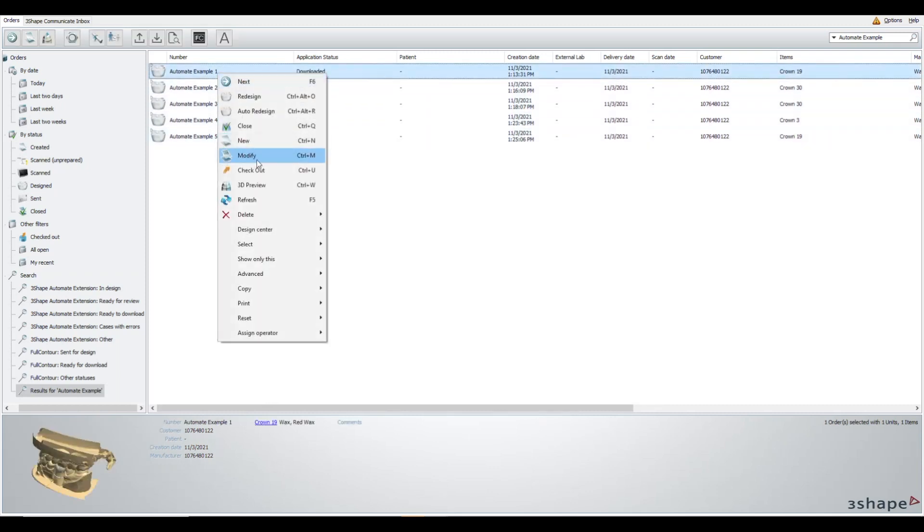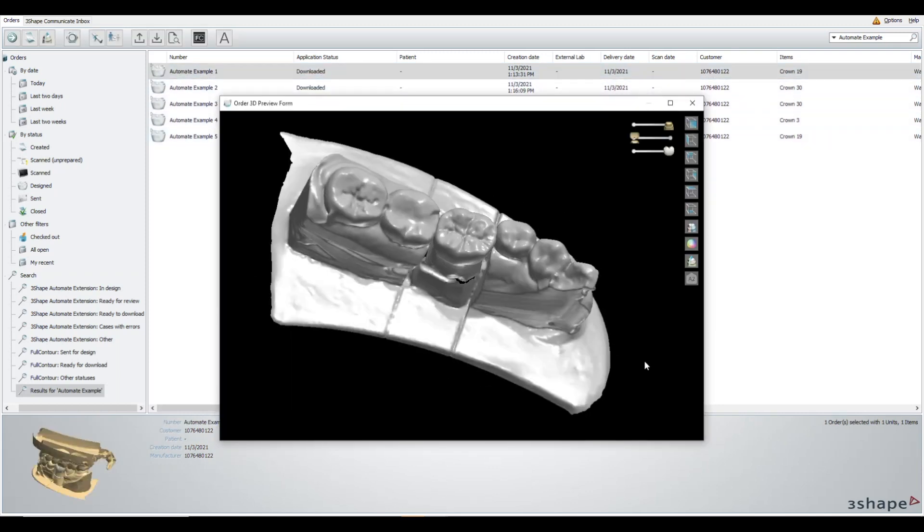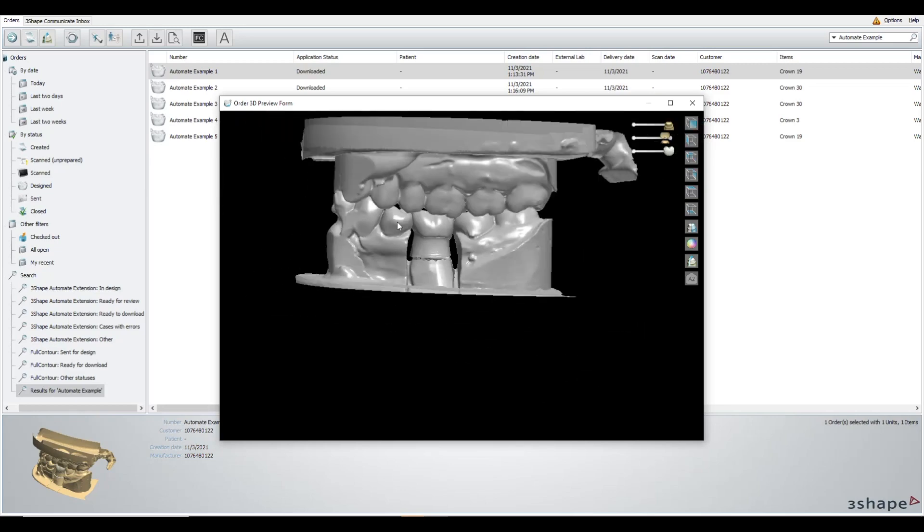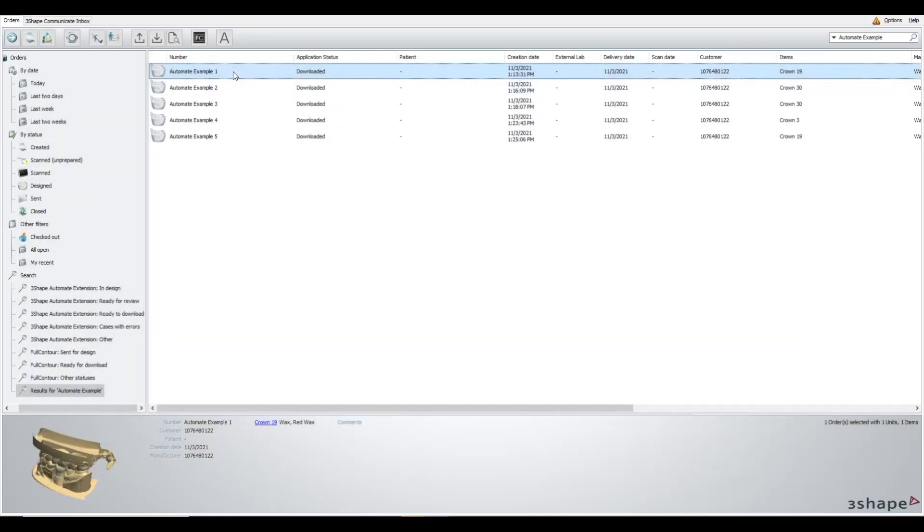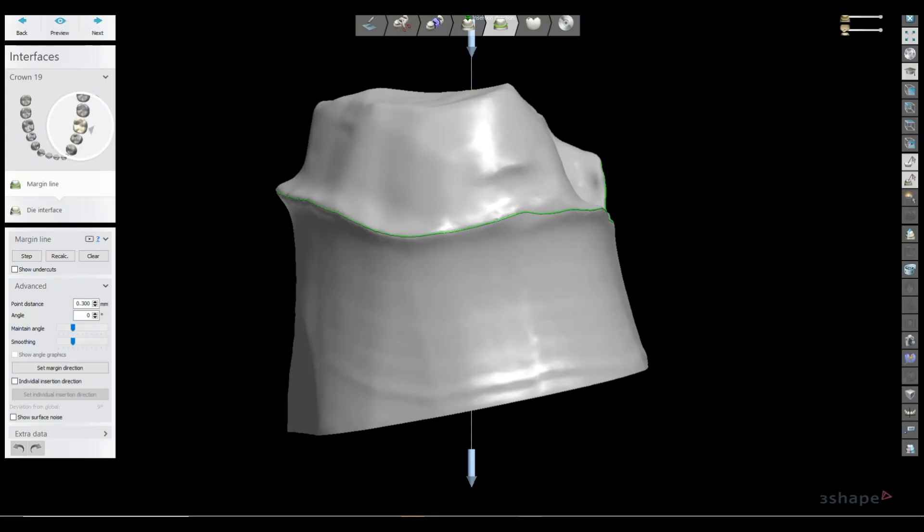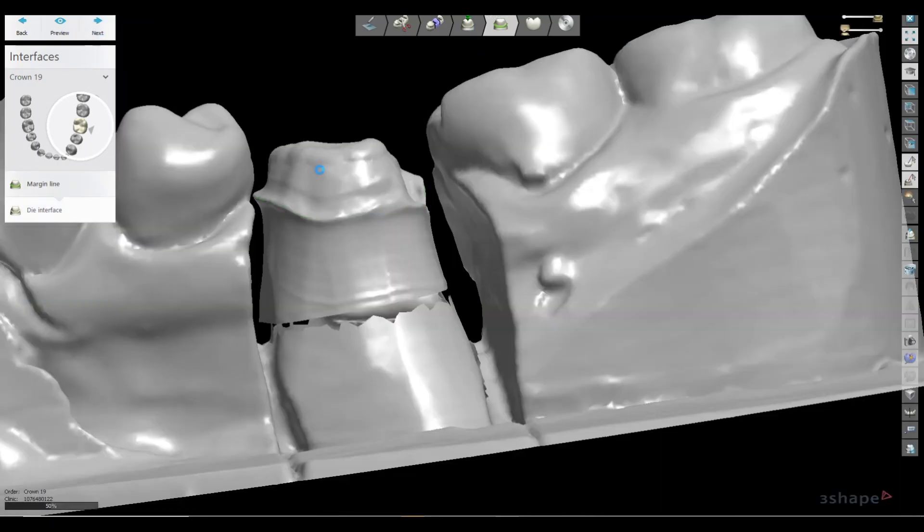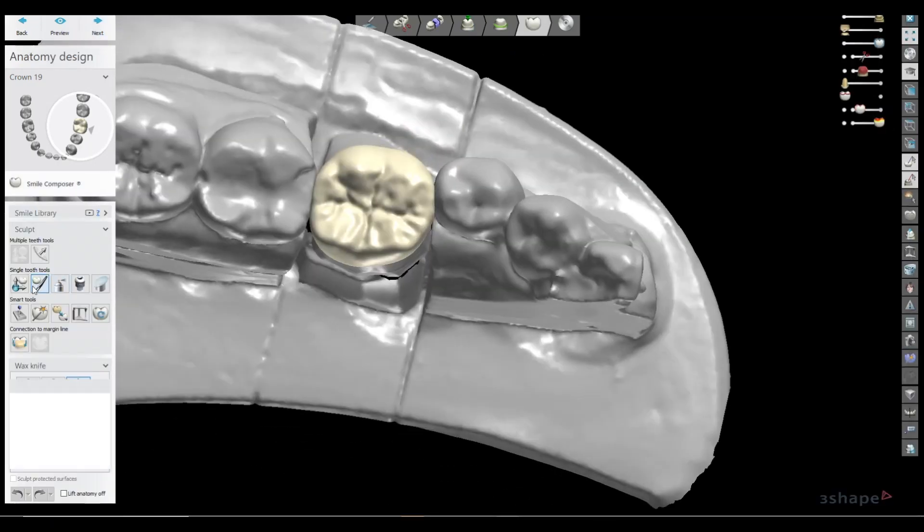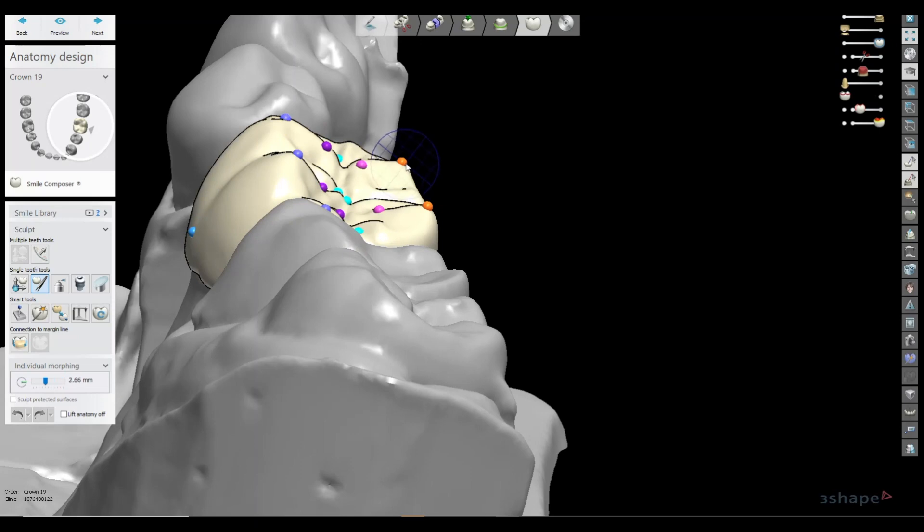Also, you can 3D preview the case in Dental System 21 after you've imported it. And then if you click redesign, it'll go through the design steps where you could confirm the margin line and import the Automate design.